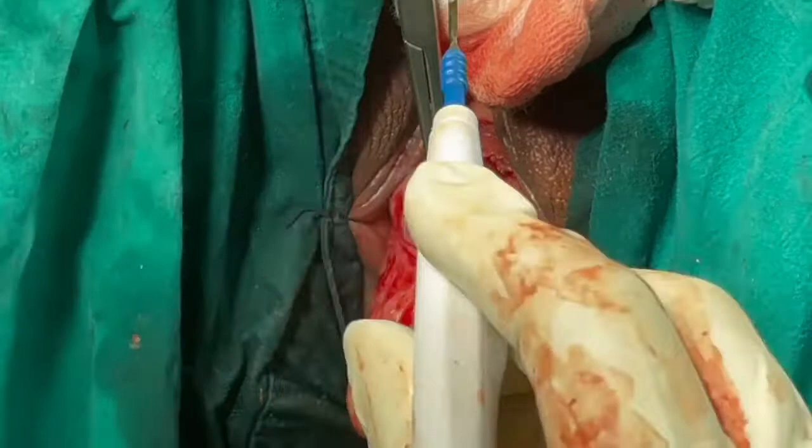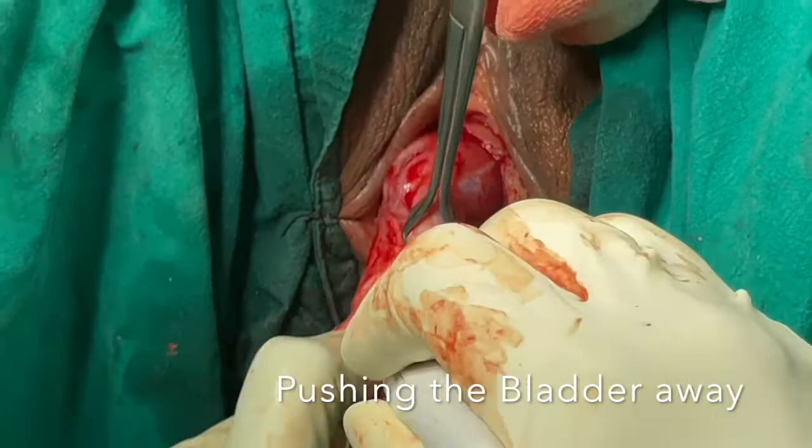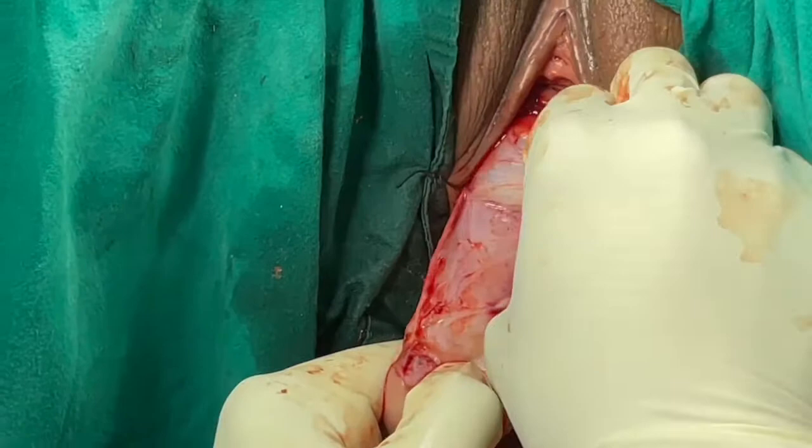Now you can see the pubovesicocervical ligament has been transected using the cautery knife, using the cut current. Then the bladder is pushed high up until you see the vesical fat, which demarcates the upper extent of dissection.